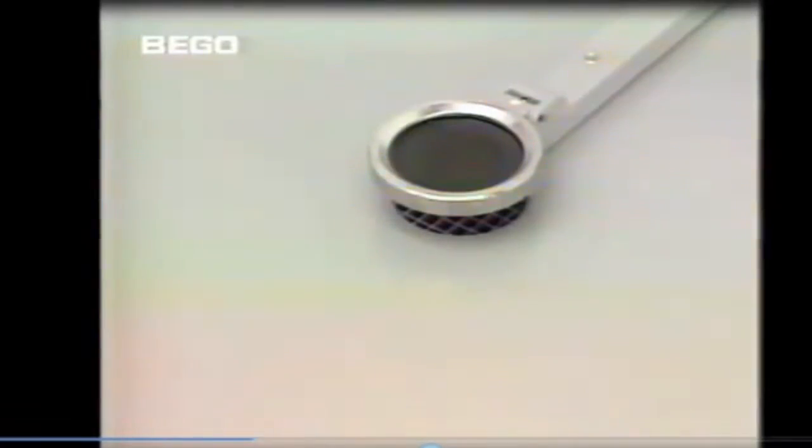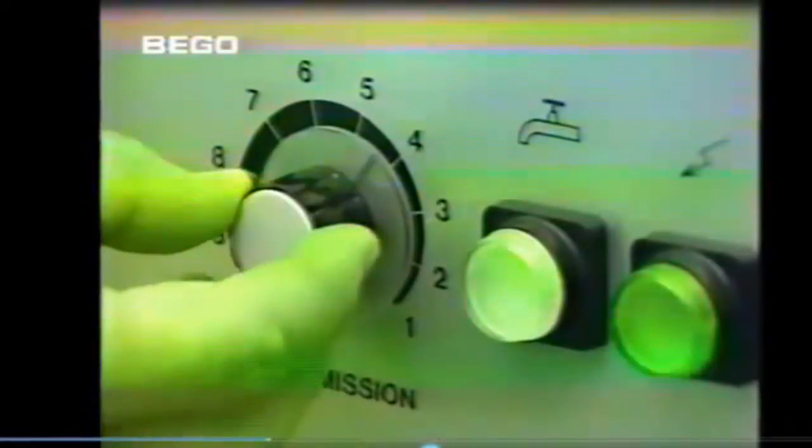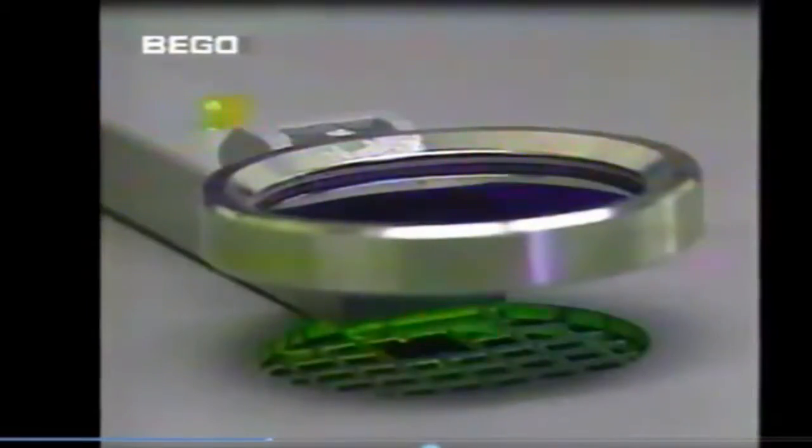A measuring cell registers the infrared radiation emitted by the melting alloy and converts it into an electrical pulse. This pulse controls the induction current to prevent the alloy being overheated during melting.